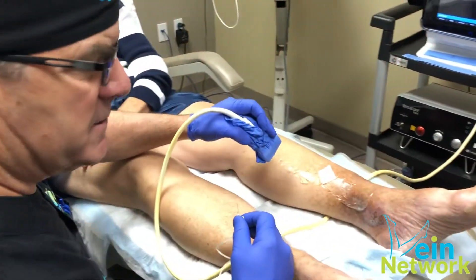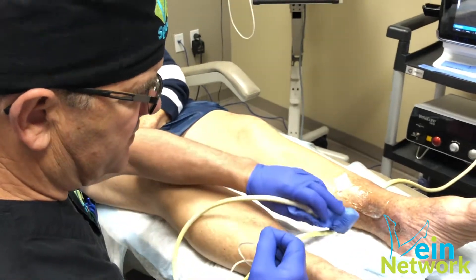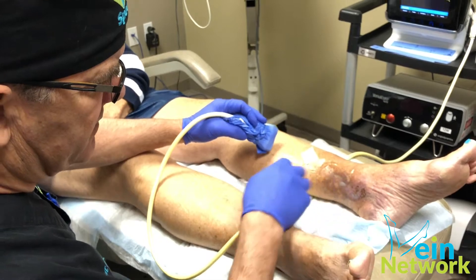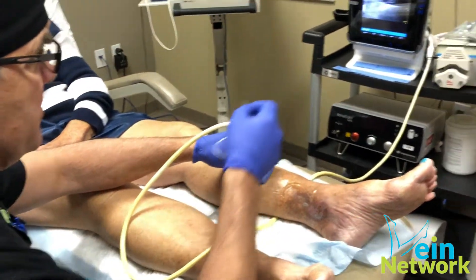Today we're doing ultrasound guided sclerotherapy on the residual branches of this patient's leg, who has an ulcer and a lot of stasis dermatitis. She has some residual branch up there that you can see on the screen.